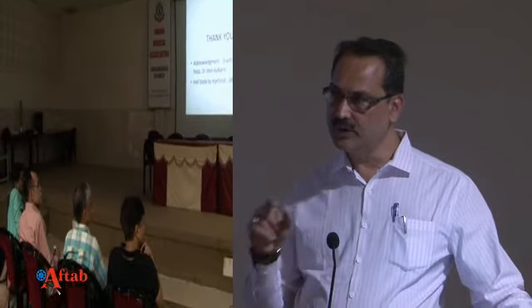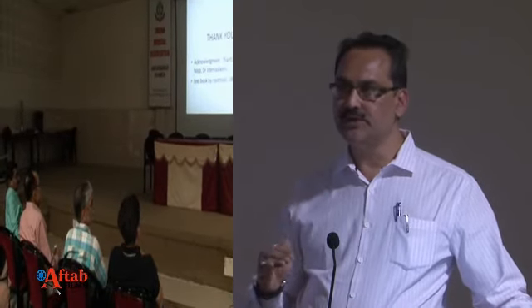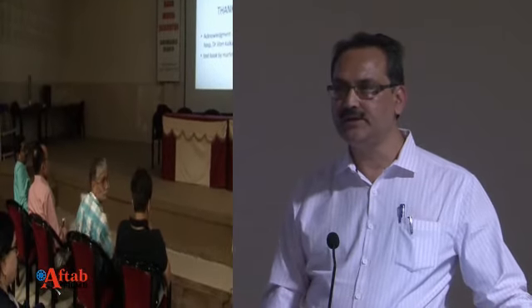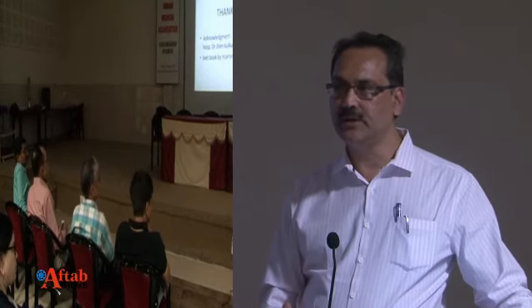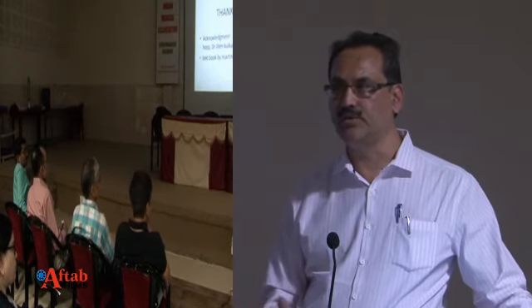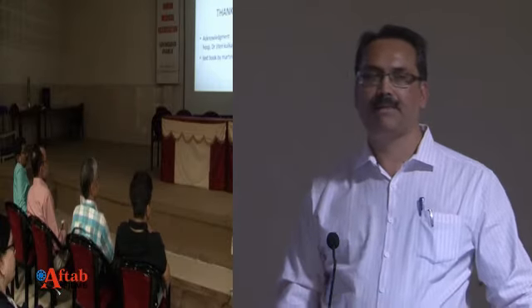Yes. That's why such interactions are more needed. If you come across such cases, then we can send the live images also if you want. With live images, you can see the entire video, you can see the entire length of the nerve, muscle, fibers, where discontinuation is there. That can be seen. And definitely with the interactions between the clinicians and the radiologists, it will improve both ways. Thank you very much.